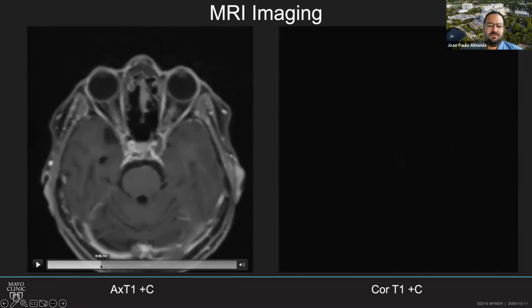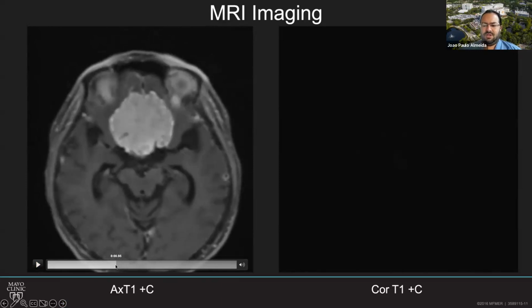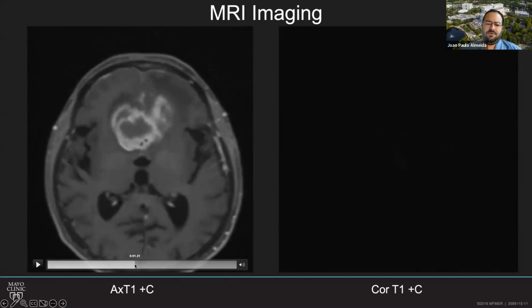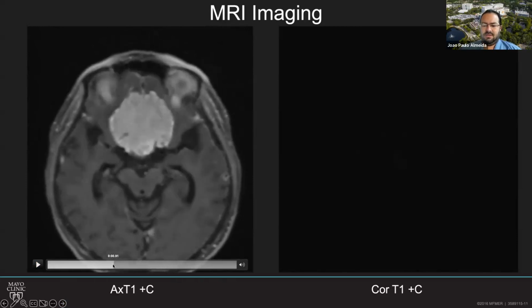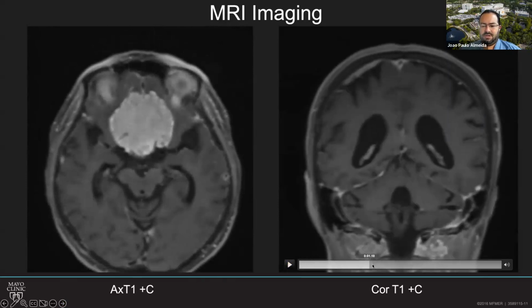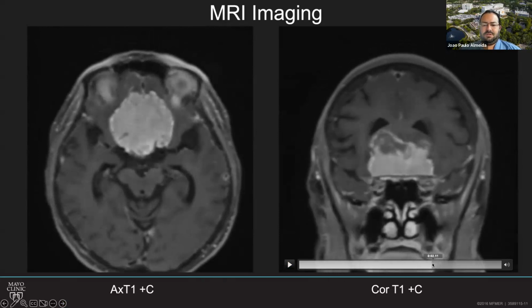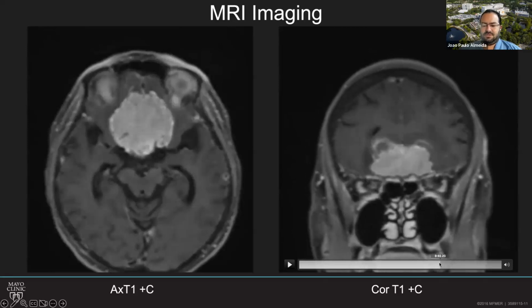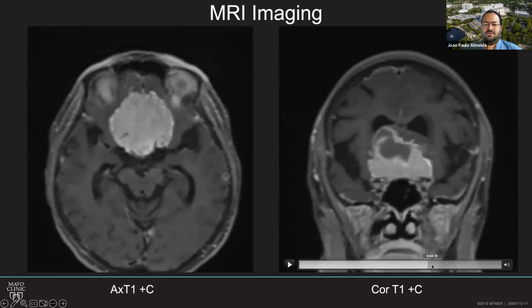So the first thing that you said, you mentioned that this has been followed as a meningioma. And then the first question that we need to have is, is this truly a meningioma, or could this be something different? For the sake of time, when you think about this, it is definitely presenting as a hyper-enhancing mass located in the extra axial space that is well-defined in borders. And the option of a meningioma remains as the number one. There are indeed other differential diagnoses that can include from metastatic disease to hemangiopericytoma to even sarcoidosis, which is not the usual presentation for this, of course.